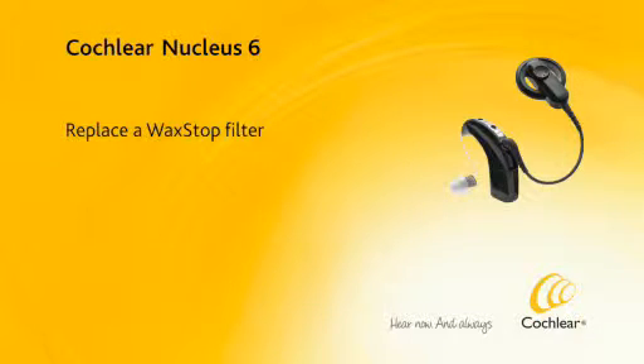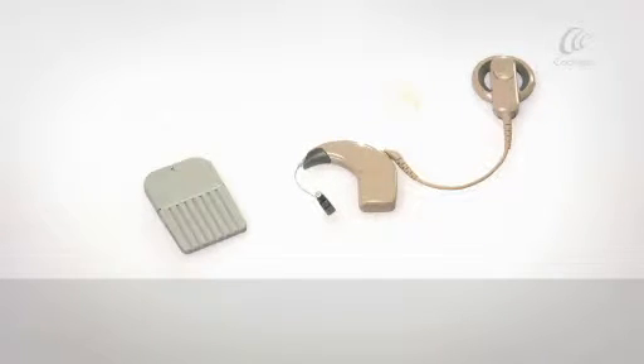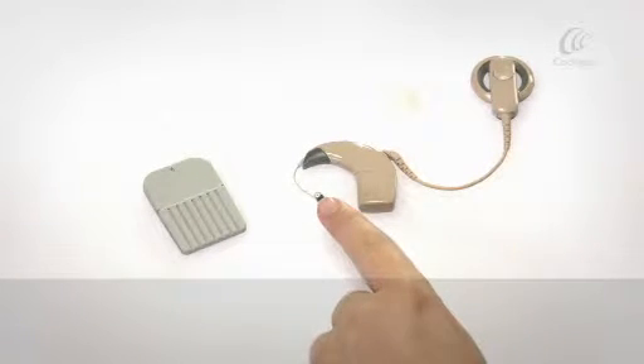Replace a Wax Stop filter. Replace the Wax Stop filter whenever it is clogged with wax or whenever the volume reduces.